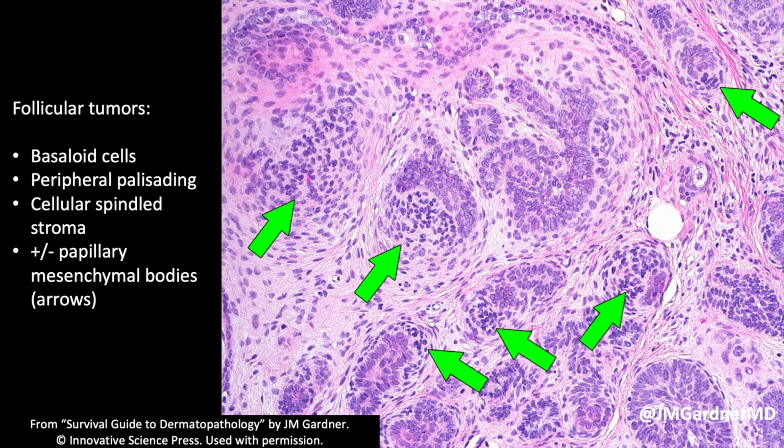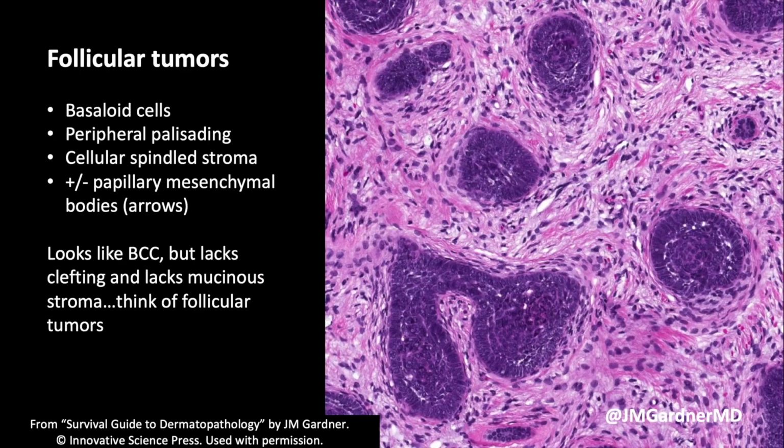And that can be a really, really important clue for not only recognizing hair follicle tumors, but even recognizing little immature vellus hairs that sometimes, particularly at margins or on frozen sections, can be a close mimic of a little island of basal cell carcinoma. So I've many times seen residents and trainees particularly make that mistake and think something's a bit of basal cell carcinoma when in actuality, it was just a little tiny hair follicle.